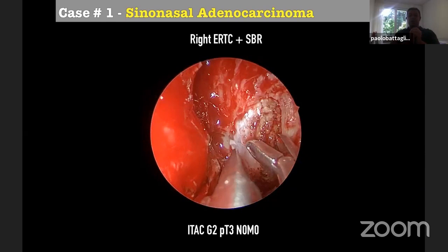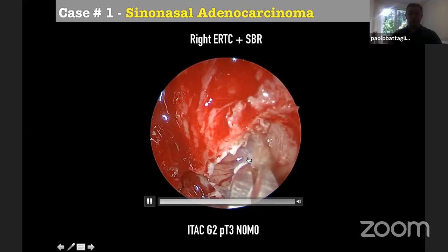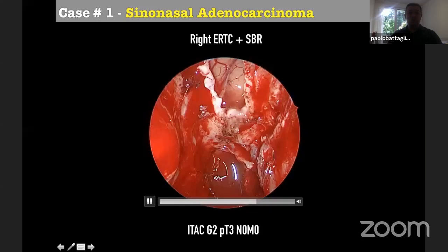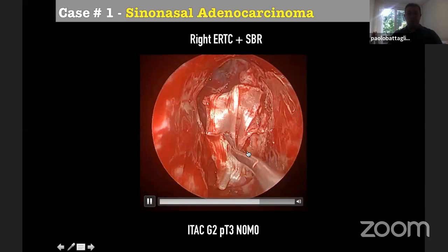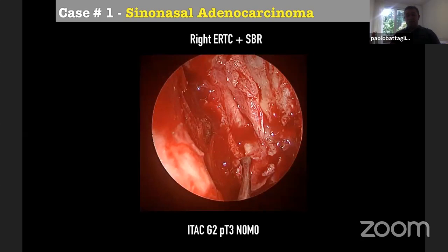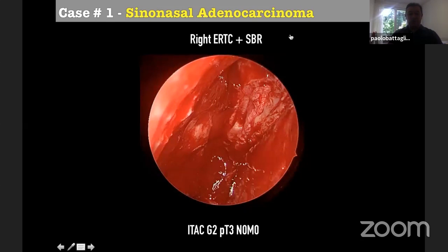But if the tumor touches the ethmoidal roof, we will open the dura, because through the olfactory fila, the tumor can go towards the brain. So here we are removing the dura, you know, the arachnoid, these white stripes here is arachnoid with the bulb over here. So we remove the dura and the bulb. And then fascia, as I told you before, intracranially, intradurally. This makes the dura migrate on the surface of the fascia, originating a separation between the nose and the brain. And then now you see, we start to harvest the flip flap.